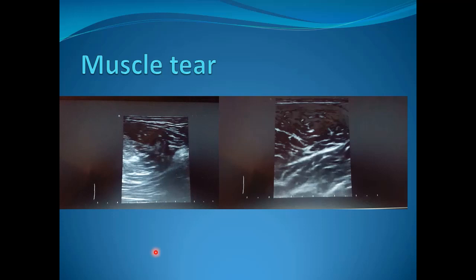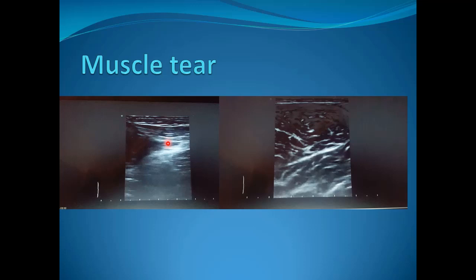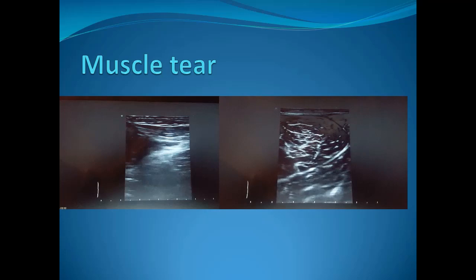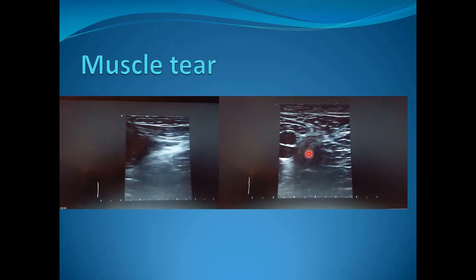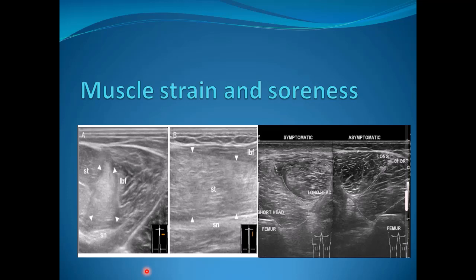This is an example of a chronic tear on longitudinal scan, where we can see the retracted fibers in the muscle with a thinned-out distal part. The transverse view for the same lesion also shows the thinned-out distal part.